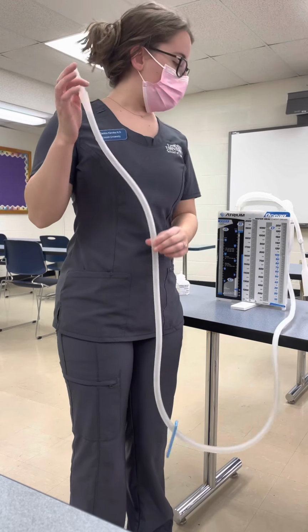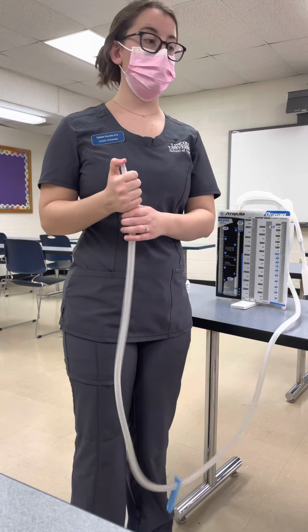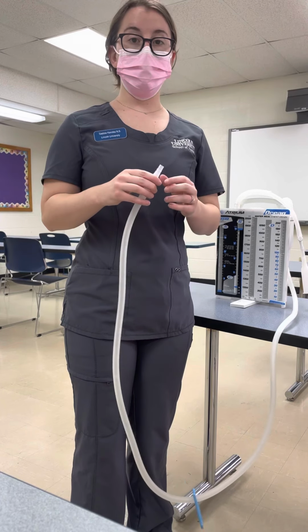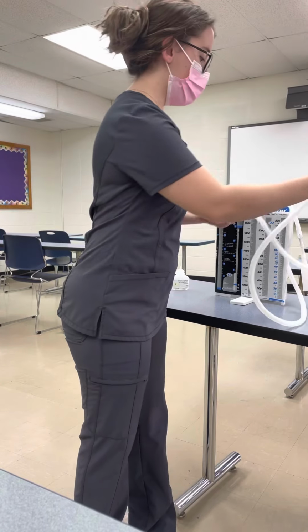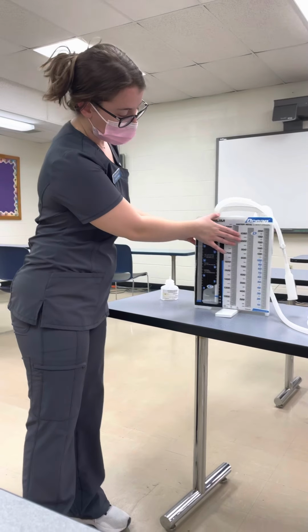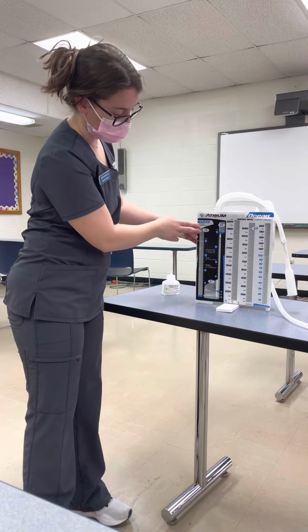We have our tube here, so that will be connected to each of the drains by a Y connector, and we'll make sure to address those so that they are sealed properly so no air leaks can occur. And then we have our actual system here. So we have our 3 chambers here. We have our collection chamber, our water seal chamber, and our suction chamber.